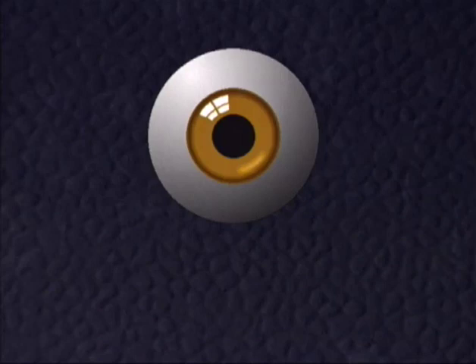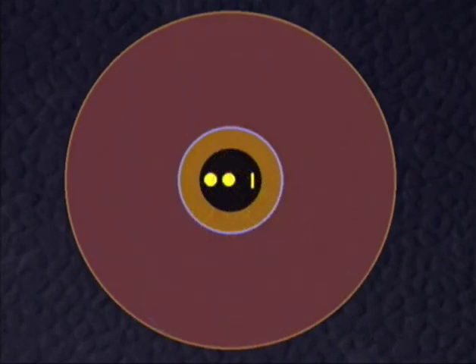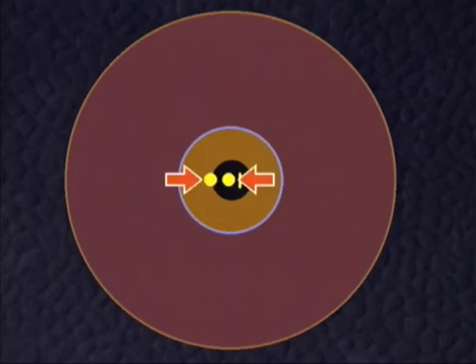If we look through the pupil, here seen with a contact glass, 3 bundles of rays must pass the pupil, the 2 bundles of the microscope lenses and the bundle of rays of the illuminating light. In the case of a narrow pupil, space may not suffice for all 3 bundles to pass. Here there can be neither light nor binocular vision. To restore illumination, the light is approached to the observation beam by moving the light beam towards the microscope. To restore binocular vision, the distance between the microscope bundles must be reduced, and with proper alignment, a position can be found which allows all 3 bundles to pass.